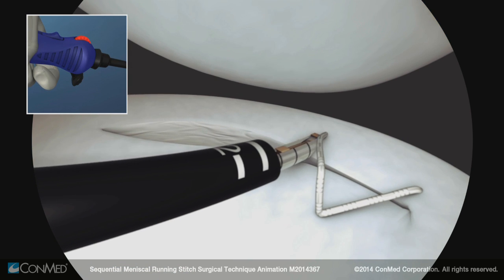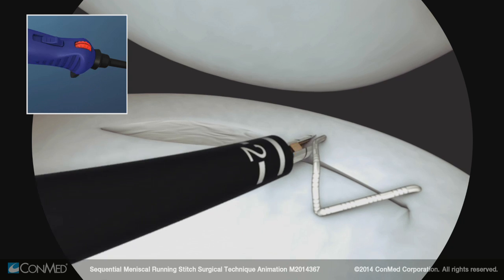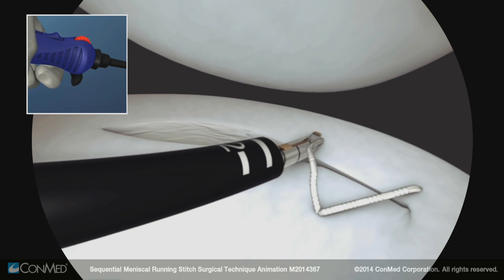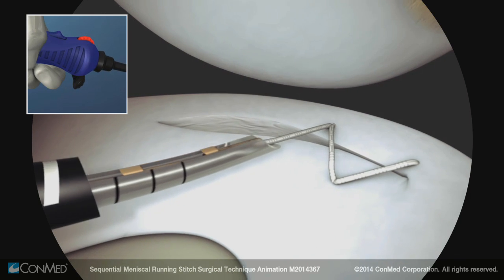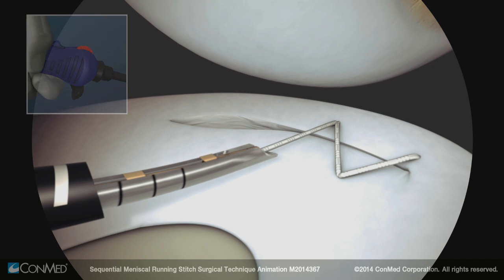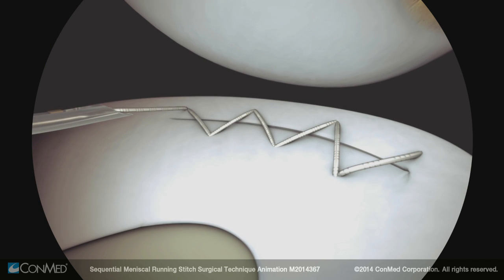Repeat the steps to create multiple sequential stitches: pierce the meniscus, rotate the device twice, advance the trigger to reset, then pull and release the trigger to deploy an implant. Withdraw the needle from the meniscus and tension the stitch. Continue creating sequential stitches until the meniscal running repair is complete.